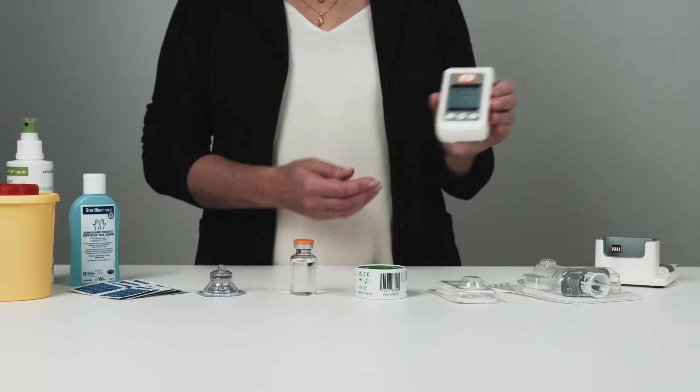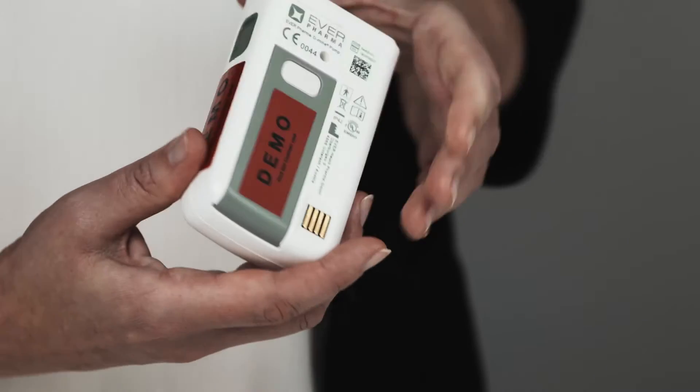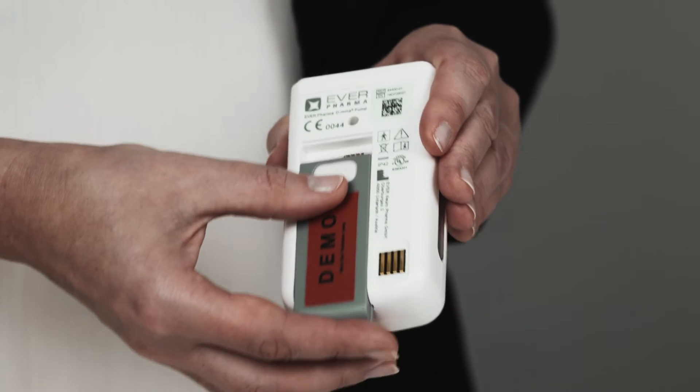The D-MIME pump is a self-filling electronic pump that has a colored display and is powered by a rechargeable lithium-ion battery. The dose in milligrams can be programmed for up to five different time windows, and the programming is protected by a code. Delivery-specific information is stored on the pump and can be downloaded using a USB.